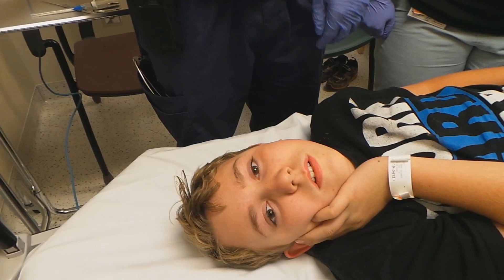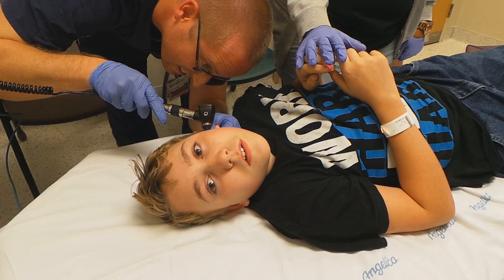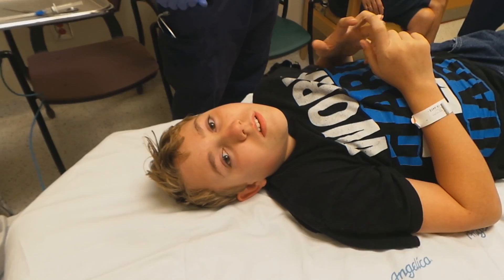Everybody did a great job. Good job, good job. The medication is going to make me silly. I'm just looking this way. You're already silly! Did you say it worked? It worked. Yeah, it made you silly. I meant real silly. Like a comedian? Yeah. All right, so what you're doing is basically making sure there's no other foreign bodies. That's exactly right — we did too, just to make sure.